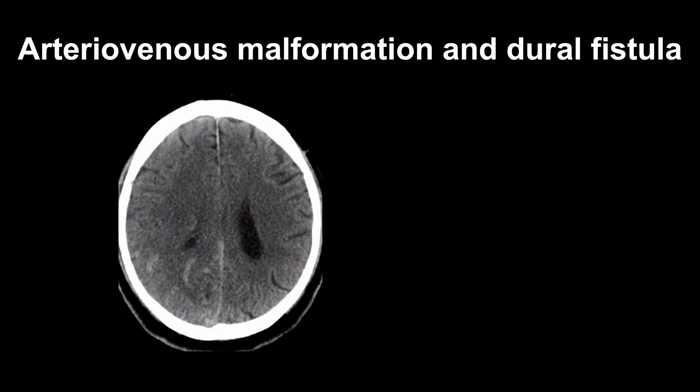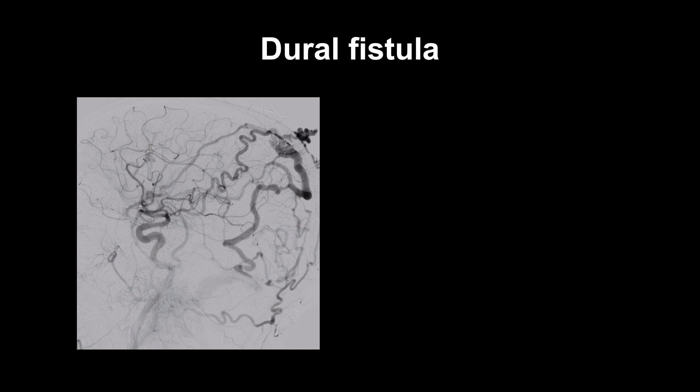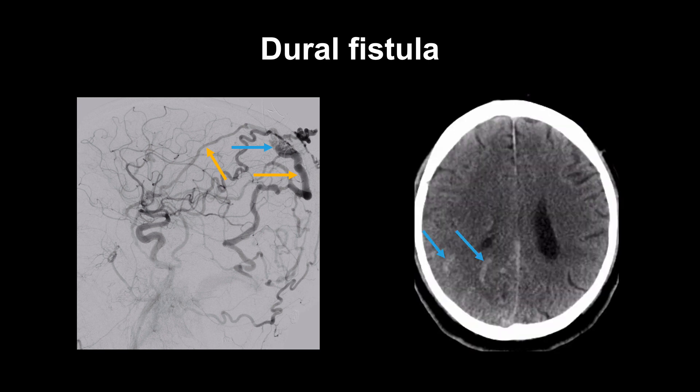While the findings in this case resemble subarachnoid hemorrhage, notice that the high attenuation appears to be within the brain itself rather than the cortical sulci. That finding suggests these are abnormally enlarged blood vessels associated with a vascular malformation rather than intracranial hemorrhage. Normal intravascular flowing blood will look whiter than normal brain due to its higher attenuation in patients without anemia. The catheter angiogram in this patient demonstrated a dural fistula with large draining veins, accounting for the abnormal vessels seen on the non-contrast CT scan.